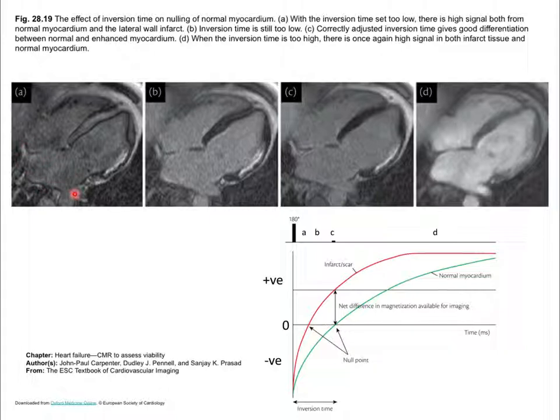If you get rid of those phase shifts, the artifactual ones, then you can make an image of a negative magnetization vector. When this signal is positive, this will be negative. Over here, this would be very dark. It would be less than 0, right? And so basically, all of these images, when you do phase-sensitive reconstruction, look about the same, right?